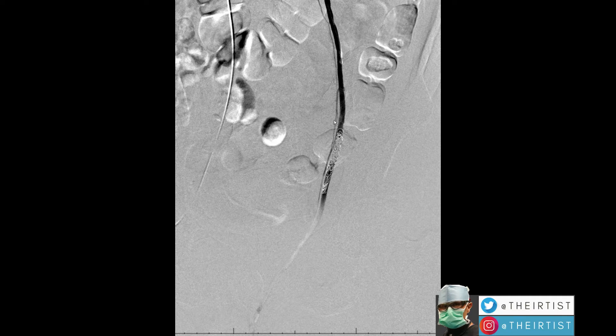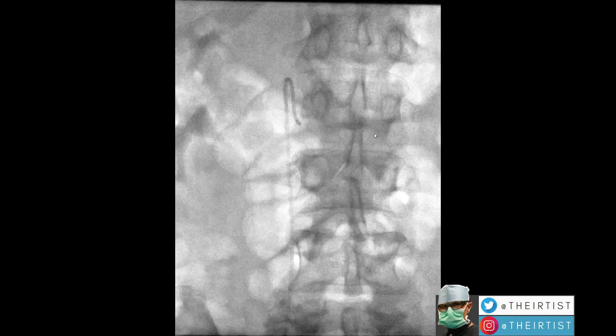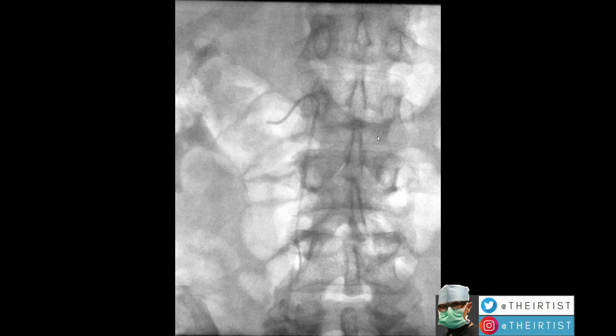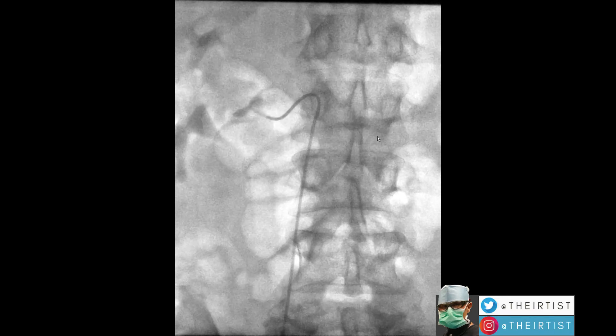It may become a potential source of recurrence, and some people treat it systematically. In this case, there was no need to treat it.